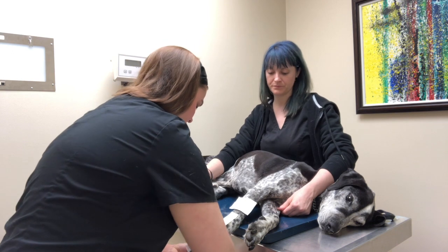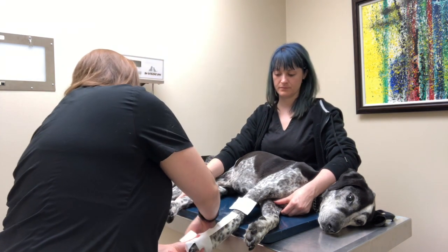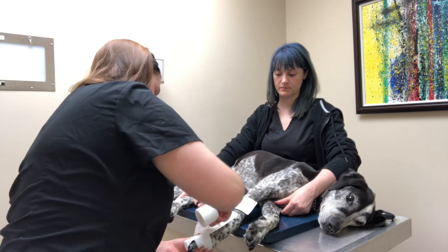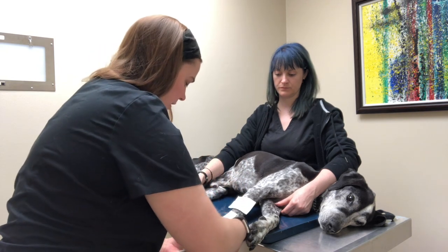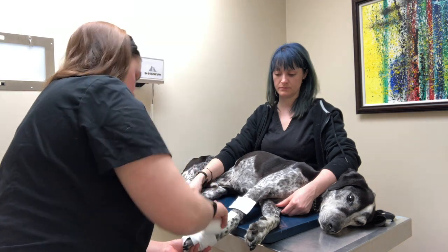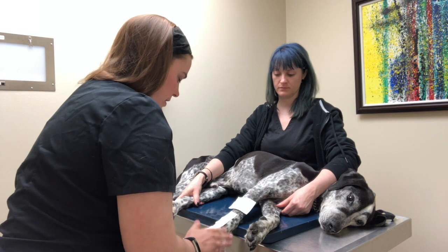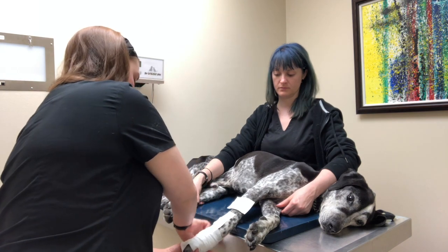We want to wrap from the distal part of our limb up to the proximal portion. And as we go, we're going to cover 50% of the padding that we've already laid. And you want to do this somewhat tight and as wrinkle-free as you can.